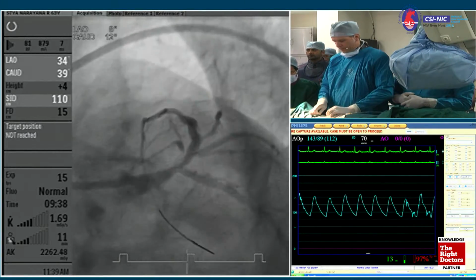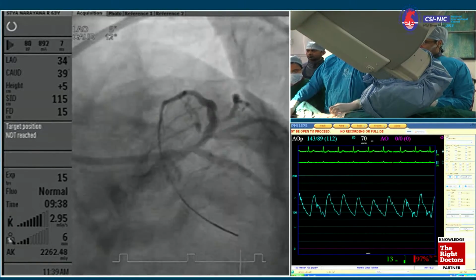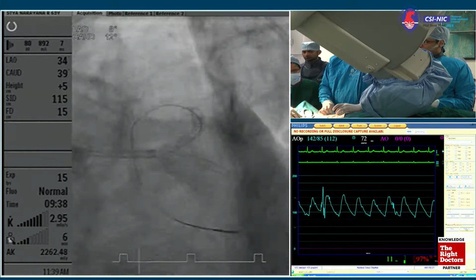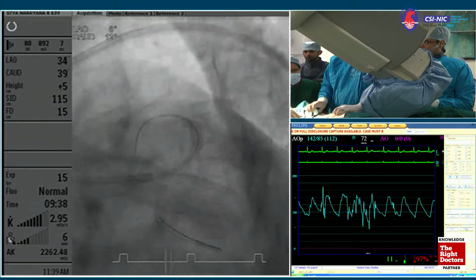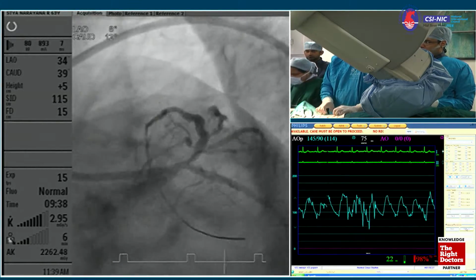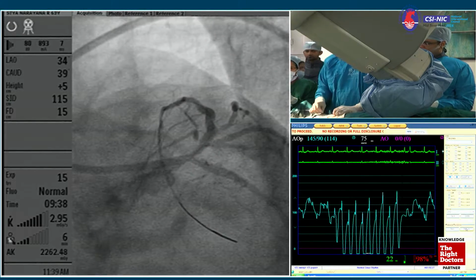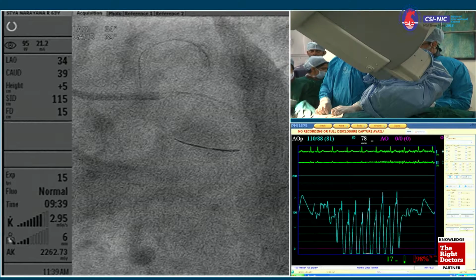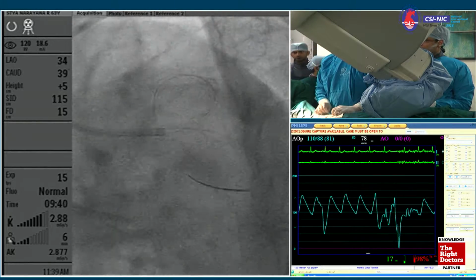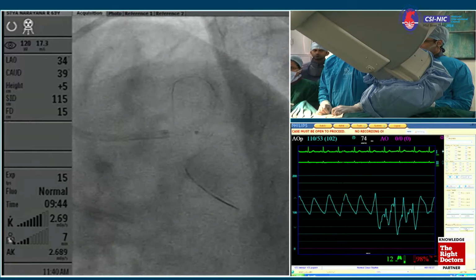This is Dr. Bang. I would like to ask you, looking at the ostium after the stenting of the circumflex particularly, I think cutting balloon or some sort of AngioSculpt should have been used before stenting this, because it looks like it has not opened up. Now, this will produce more restenosis chances in the long term. Okay, is this a non-compliant balloon? So I'm quite happy with your comment. Unfortunately, I don't know if a cutting balloon would really bring a better result. We talk about that, but we never show it.